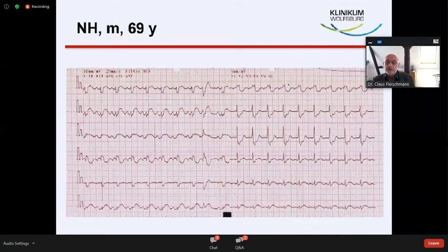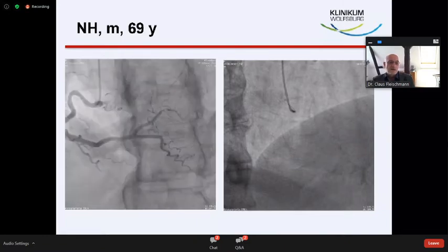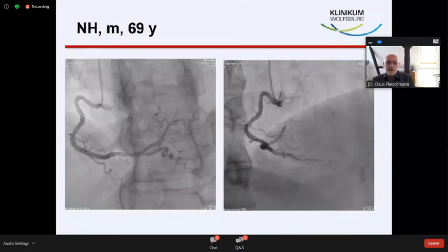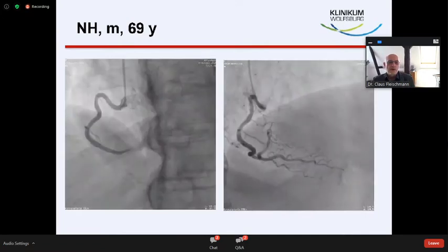We don't know this. So we brought this patient to the Cath lab, and still when he arrived, it's not really good hemodynamically. The tachycardia is less now, 80 only, not 115 as before, but the blood pressure is low, and we start the coronary angiography, looking for the right coronary artery, which you can see here is a normal sized artery, no severe atherosclerotic disease. And we can not really see collaterals to the left side.